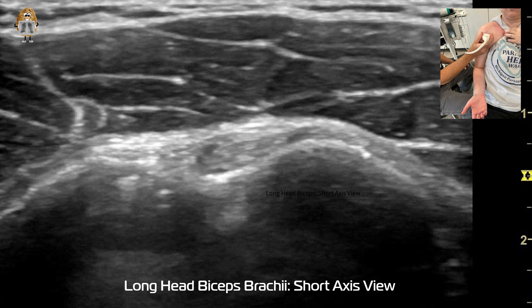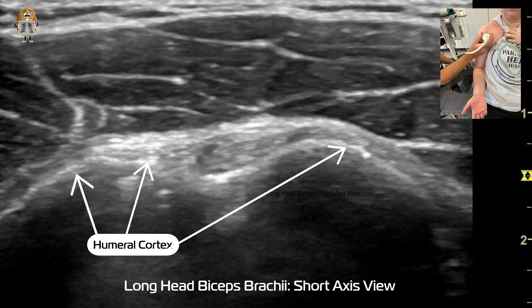The transducer is oriented to do this short axis view of the long head of the biceps. The left side of the screen is going to be the medial side.